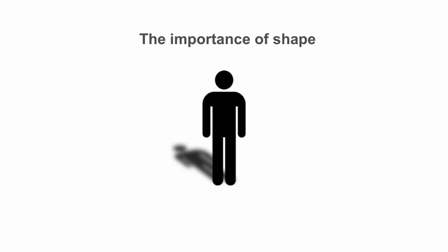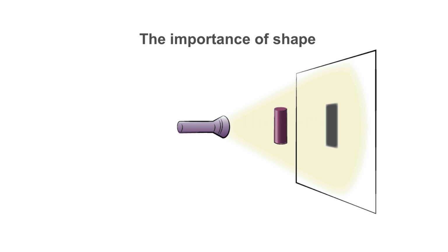By understanding the shape of the object and the direction of the light beam, we can predict the shape of the shadow. There are analogies to this also in the X-ray world. We take a solid cylinder and stand it upright. If we shine a light beam on the cylinder so that the beam direction is perpendicular to the cylinder, the shape of the shadow is a rectangle.